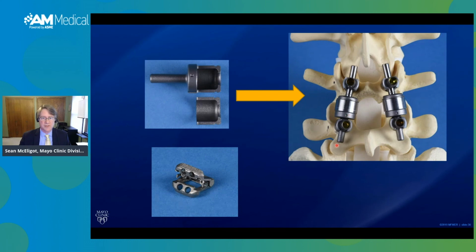This is the facet joint replacement product. A team of engineers from the Division of Engineering worked with Dr. Mohammed Biden to develop a facet joint replacement system that will preserve to a first order approximation the natural biomechanics of the facet joint when the facet joint has to be removed due to degradation. The current treatment is a fixed rod, which severely limits motion and can cause additional problems to the joints above and below the point of fixation. This invention has been licensed to an outside manufacturer.